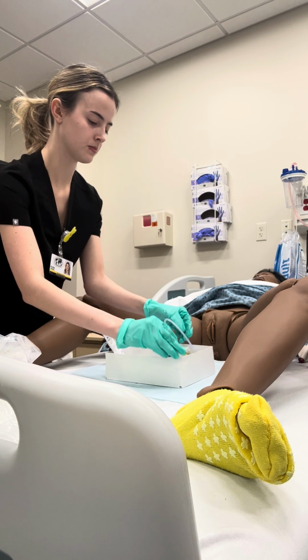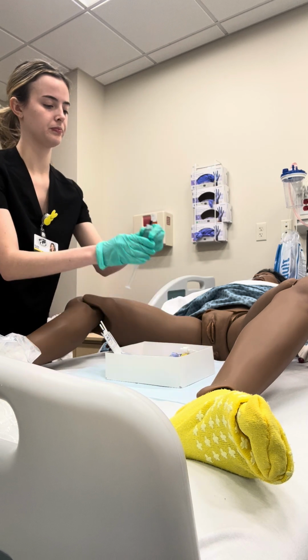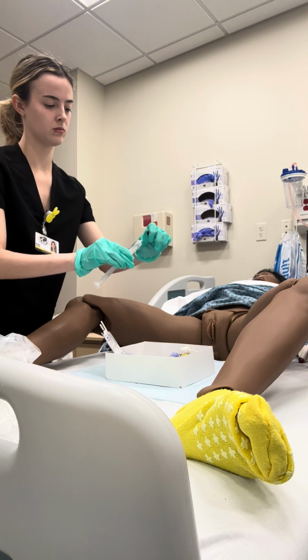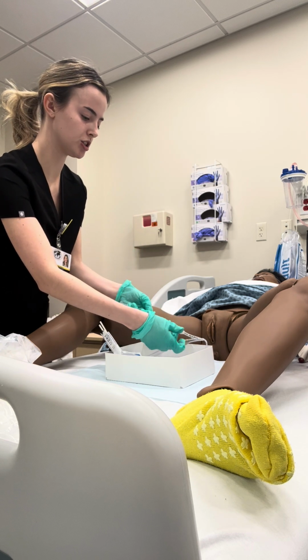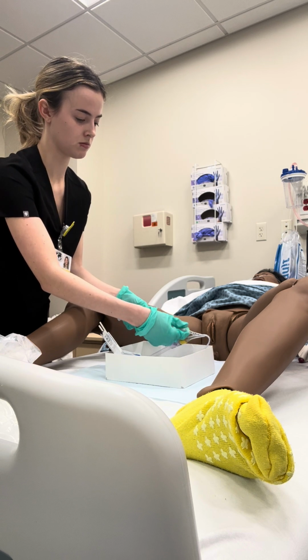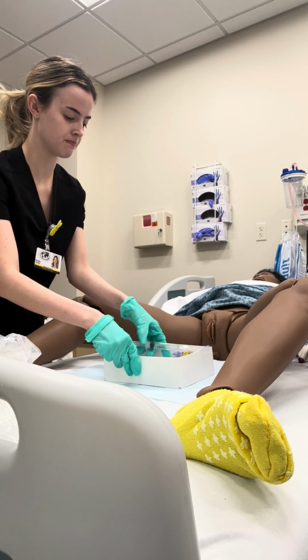Okay. And then I'm going to go ahead and attach my syringe to my catheter so that it's ready to go.